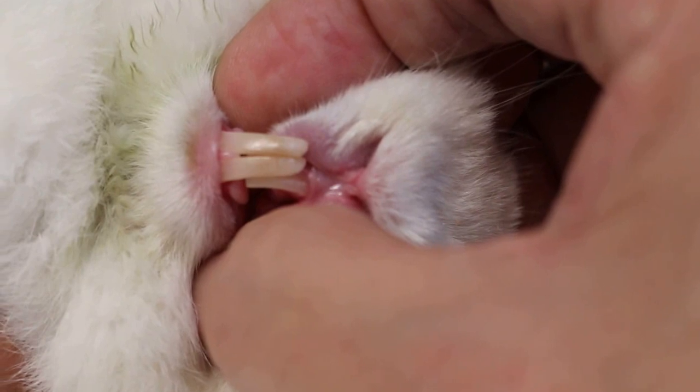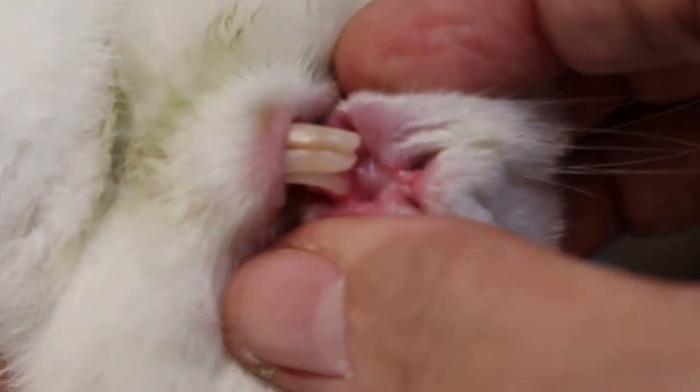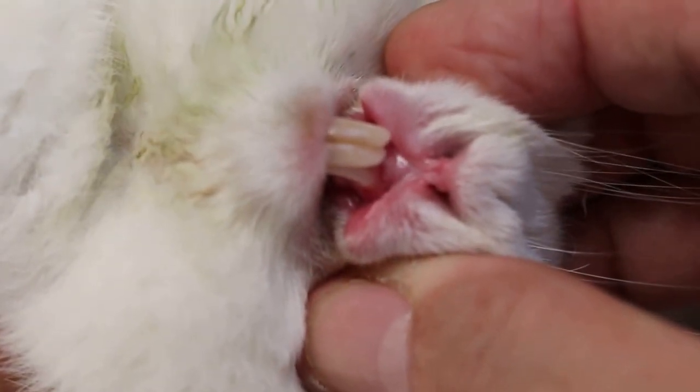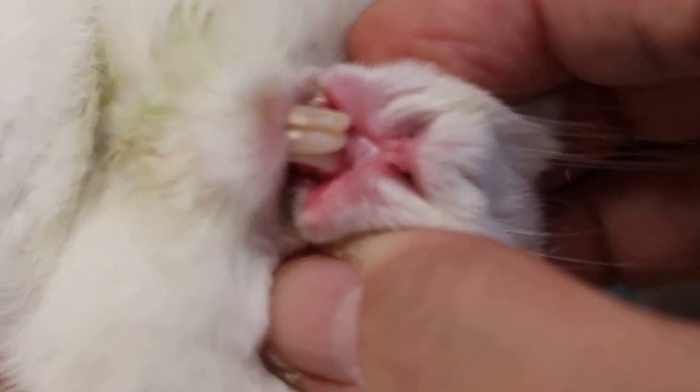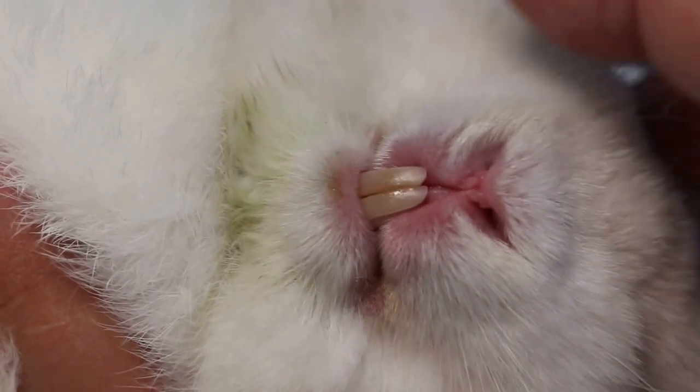So the best is to extract the upper and lower four to four teeth — actually six, there are two more behind. There are four upper front teeth and two lower front teeth, but the owner is worried about anesthesia, so we'll just clip it.